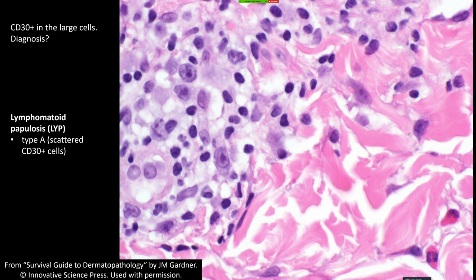But if I have some suspicion, sometimes I'll put in there, I think this is reactive, but lymphomatoid papulosis would be a possibility in the right clinical setting, because maybe this is just the first onset and they don't have waxing and waning papules yet because they just presented recently. And maybe if you follow them over 6 months or a year, you'll say, oh wow, they do have the waxing and waning course, and maybe this is just LYP. So sometimes if I'm thinking about it, I'll bring it up in my comment so the dermatologist knows to keep an eye on the patient and see how the process goes over time.